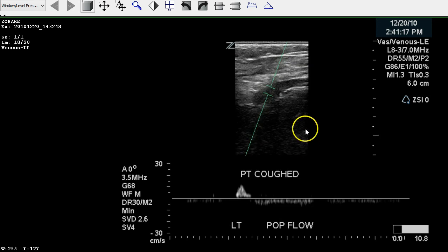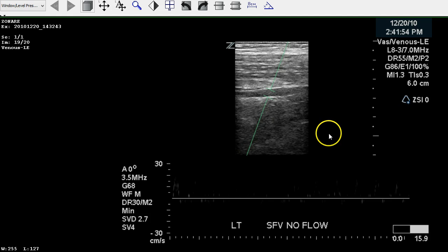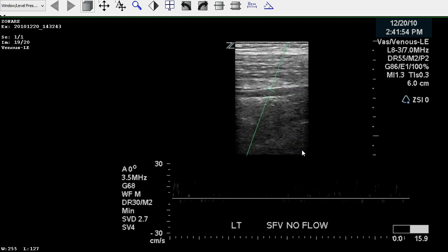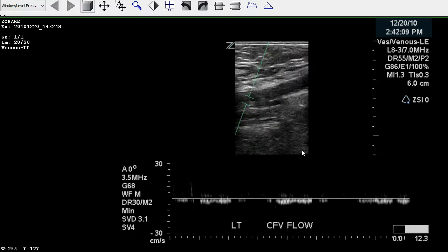We look for the Doppler here in the popliteal and can see decreased flow. Moving back, we see that there is some flow identified within the popliteal, so there's a partial occlusion of this vein. However, no flow is identified within the femoral vein in the thigh, and there is decreased flow in the common femoral.